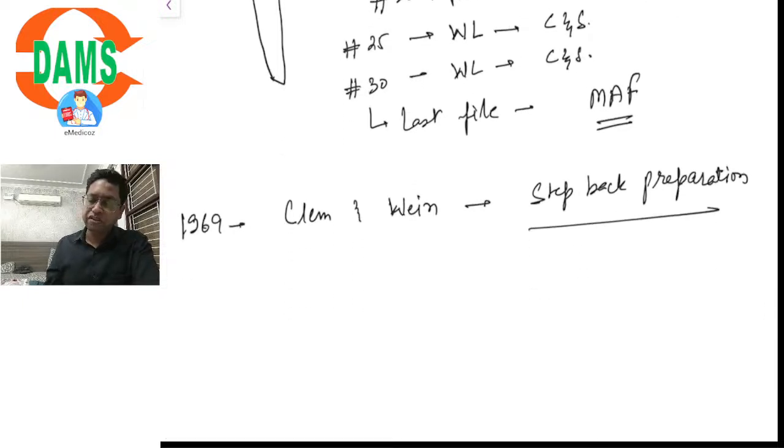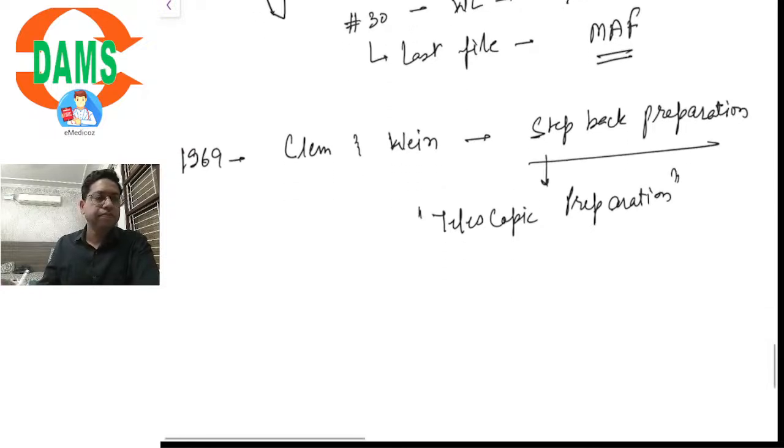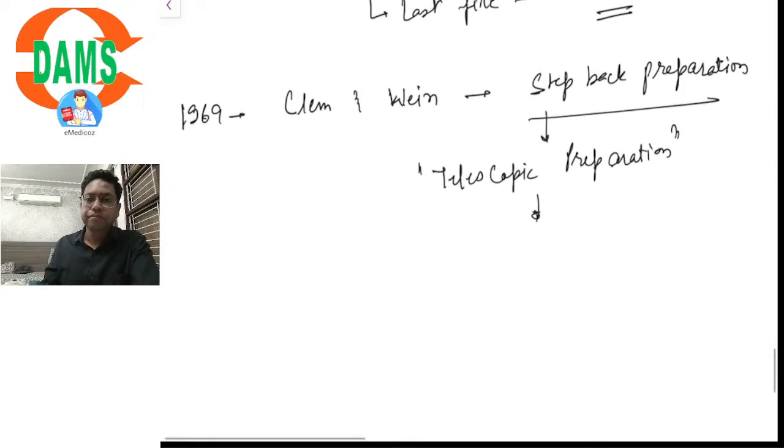Step back preparation has been modified over the years with several methods, called telescopic preparation of the root canal, or it is also called serial preparation.